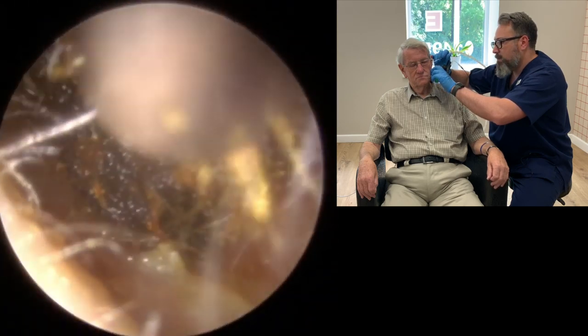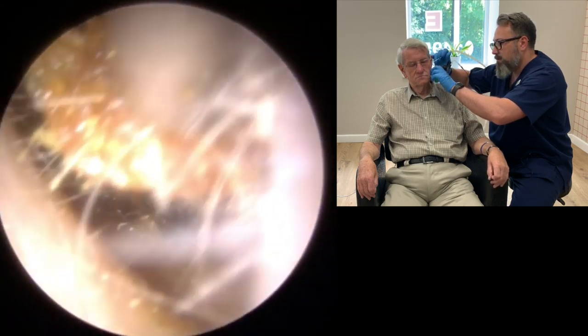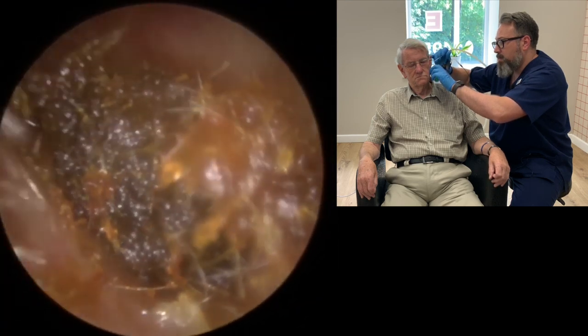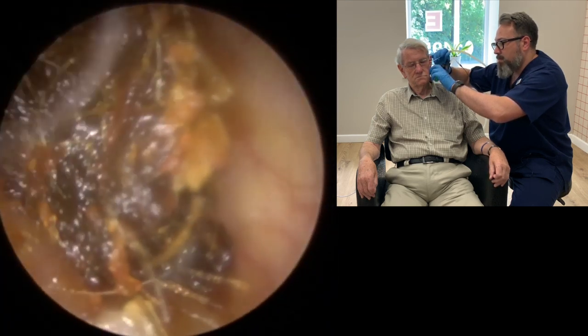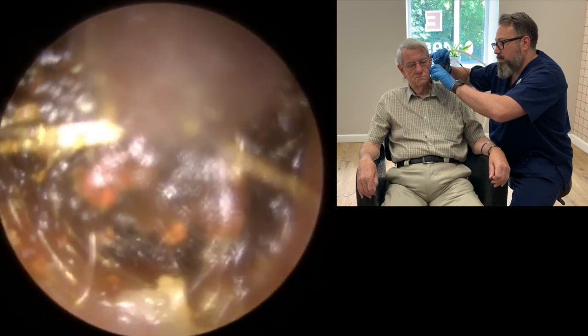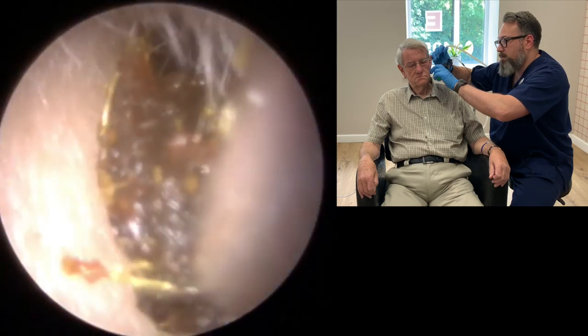So we've got the grip on that top section there, we're just taking that away first of all. That's going to clear a little bit of our view so you can see the outer part of the ear canal there. It's quite loose. We had a very similar patient the other day where you could see the canal starts to collapse when you enter it with the suction. So you've got a grip on that nice, deep, big piece of wax. There we are.